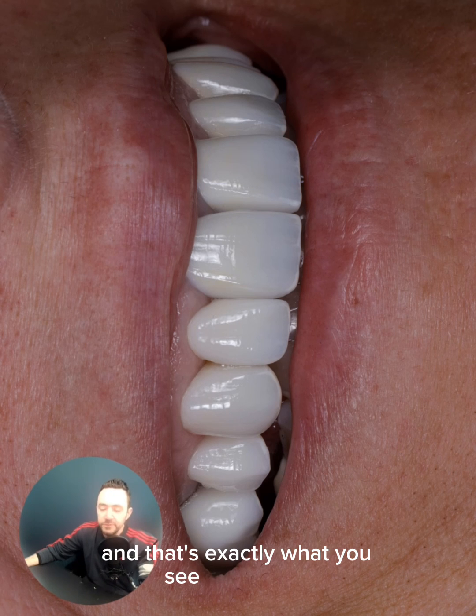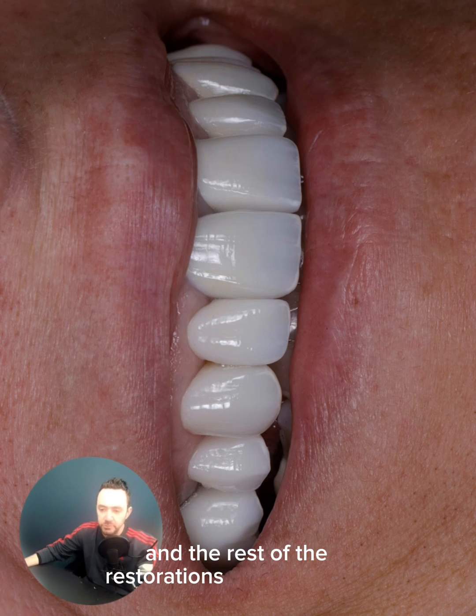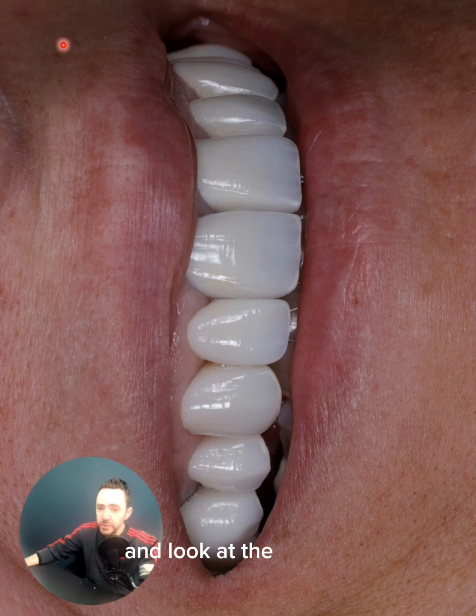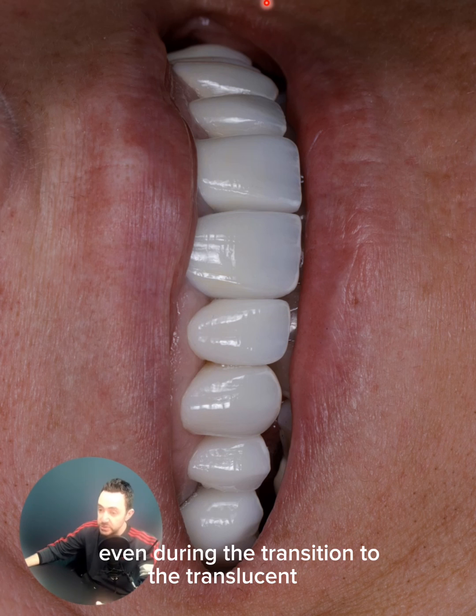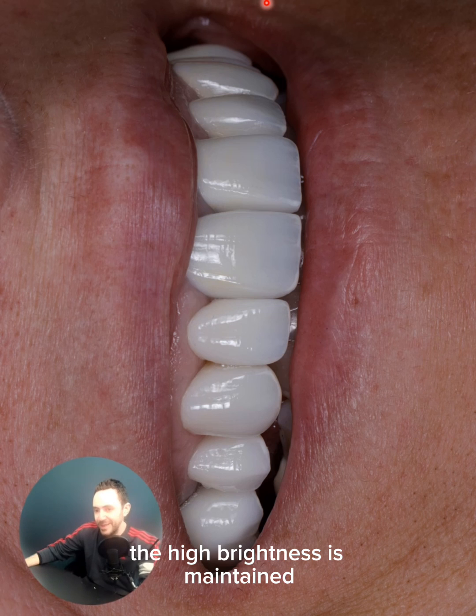And that's exactly what you see in our case here. The forefront are multi-press and the rest of the restorations are Emax CAD. Look at the natural-looking transition here in the layer progression — even during the transition to the translucent third, the high brightness is maintained.